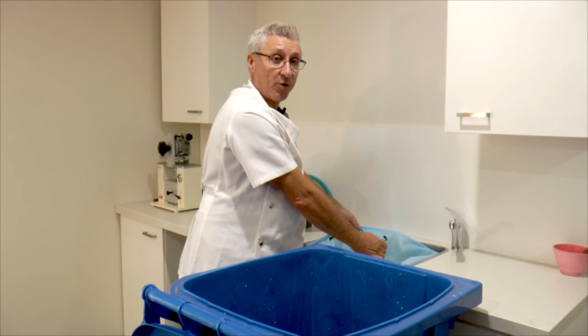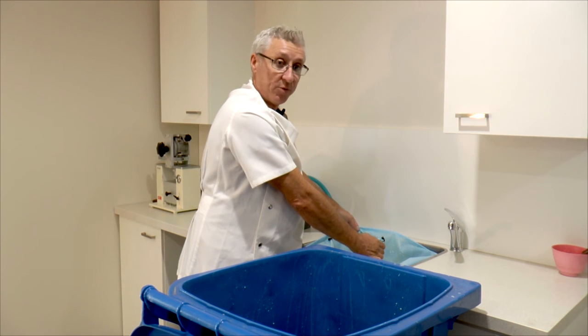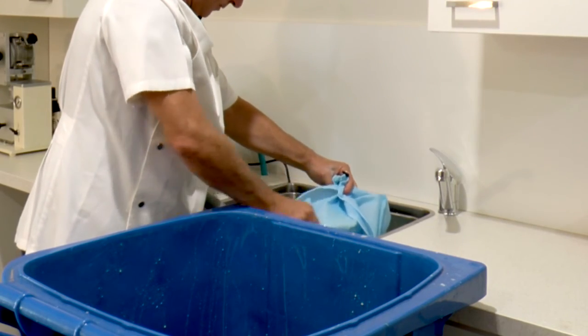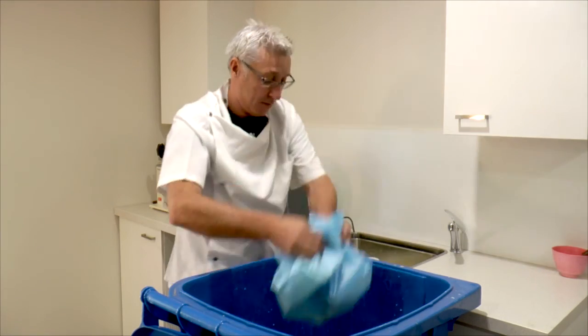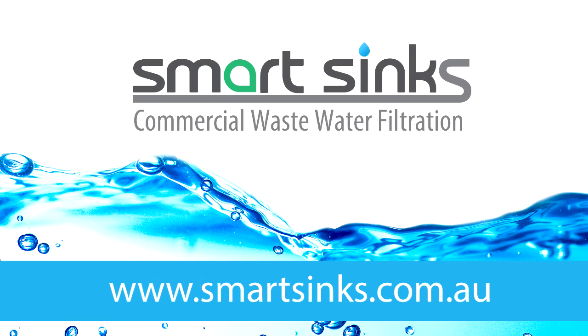After the grinding process is finished and you need to empty the sink for the day, it's as simple as lifting the bag out and throwing it away. Just like that. To order your SmartSink or for more information, visit smartsinks.com.au.